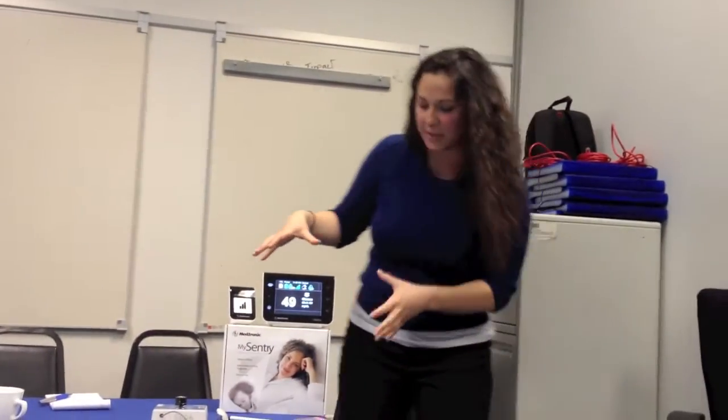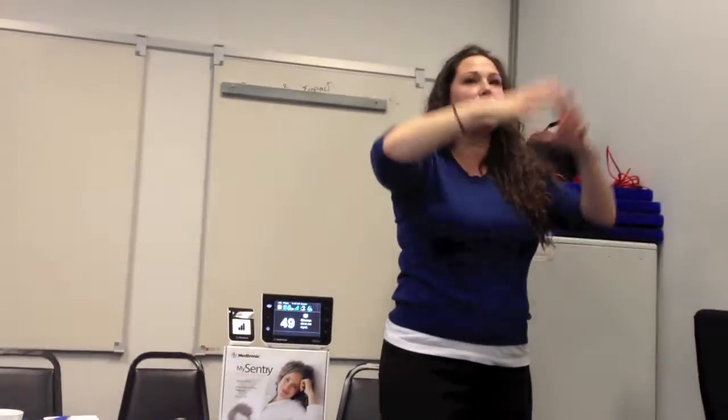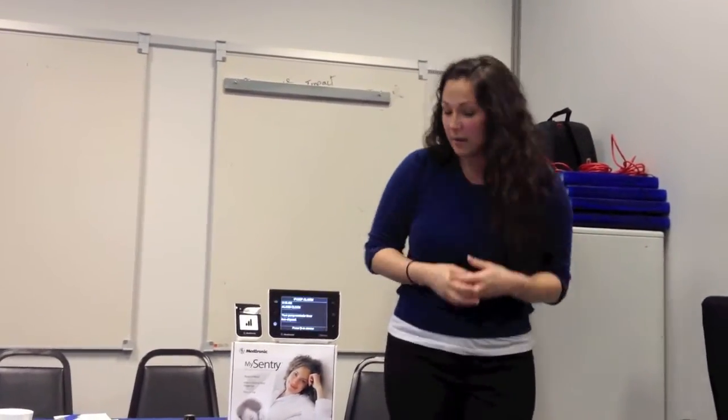And again, to Greg's point earlier, this is the way it's currently set up, but we're looking and trying to identify how can we make it so that it's whole house, so it's mobile, so you can monitor someone maybe who's playing soccer, so your child who's playing soccer, and you want to see what's going on.